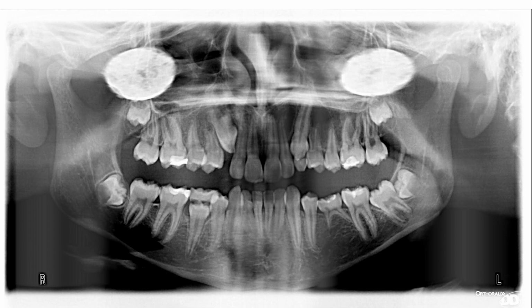It's still a good exam to assess, for example, a jaw fracture, or to see where the third molars are, if they are present, and whether they are impacted. But there are now so many indications to take a CBCT, and I go over that in my webinars. There are a lot of webinars available that you'll see on the Facebook page. So I go into detail, but panoramic is still a good exam.